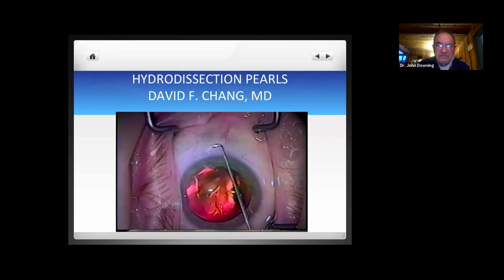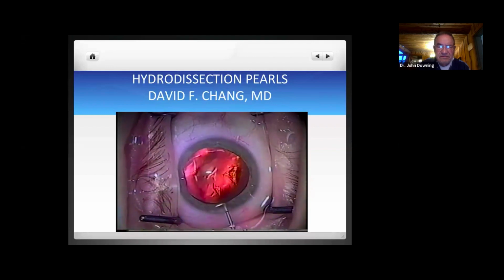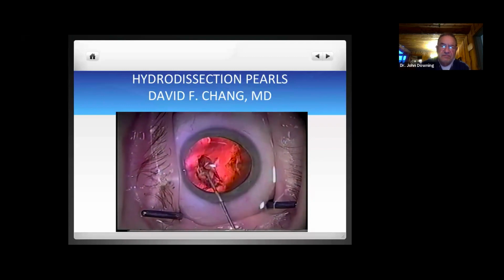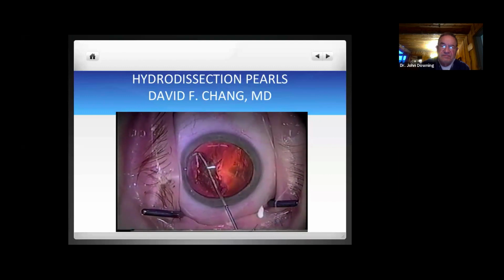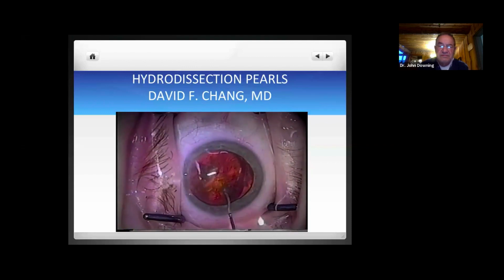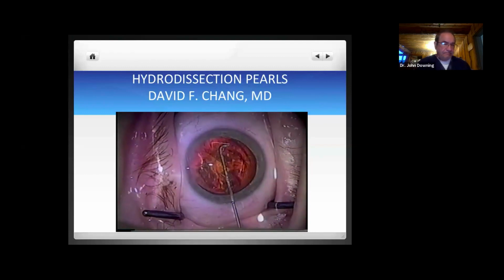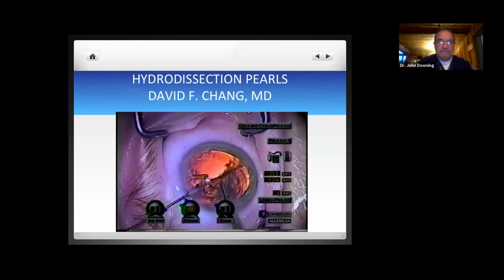So here again, it's used with a 3cc syringe. You see the jet of fluid, and being a right angle, you can get to the subincisional capsular area. And you see that nice slow wave with scalloped edge means it's right up against the interior surface of the capsular bag. The next wave is hydrodelineation, and that's by just angling the tip inward slightly, and then again confirming rotation by digging the little angled tip into the nuclear surface.